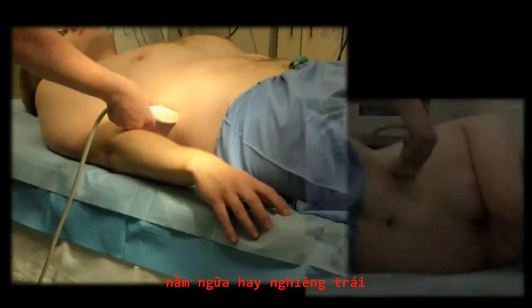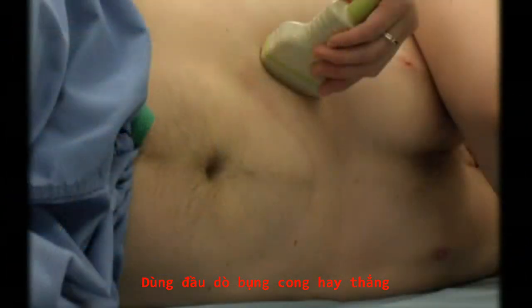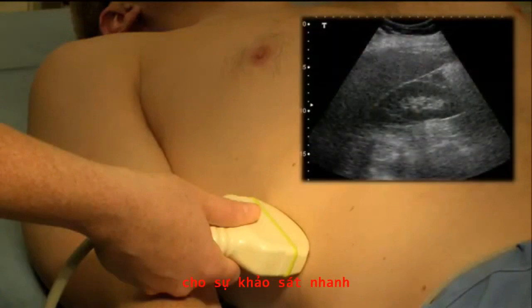The patient should be positioned supine or in the left lateral decubitus position. If unable to get a good view in one position, try the other. Use the abdominal probe or curvilinear probe in a longitudinal position either at the right upper quadrant or starting in Morrison's view, also known as a hepatorenal view from the FAST exam, with the marker aimed cephalad. Starting at Morrison's view may help orient you to surrounding structures and help lead you to the gallbladder. Having the patient inhale deeply may bring the gallbladder into view as the diaphragm depresses the liver.